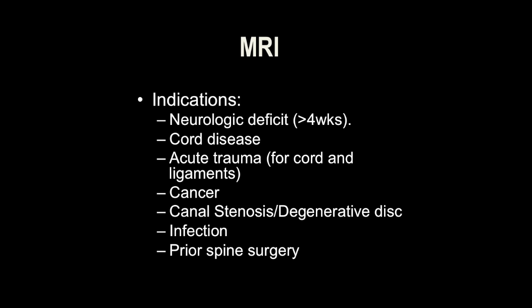General indications for MRI include neurologic deficit, cord disease, acute trauma if you're concerned for cord or ligamentous injury, cancer, spinal canal stenosis from degenerative disease, infection, and prior spinal surgery — which encompasses many indications including epidural abscesses or epidural hematomas.